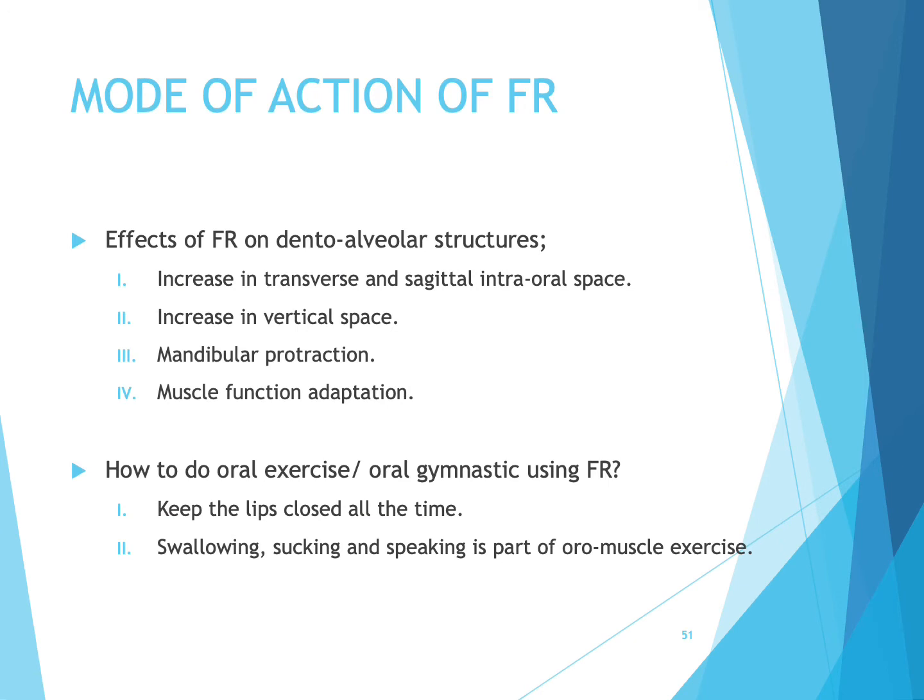So what is the mode of action of the Frankel appliance? The following are the effects of the Frankel appliance on the dentoalveolar structures. First, an increase in transverse and sagittal intraoral space. Secondly, an increase in vertical space. Thirdly, mandibular protraction. And finally, muscle function adaptation.